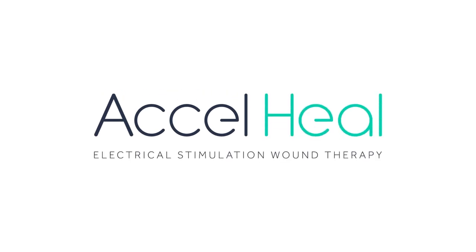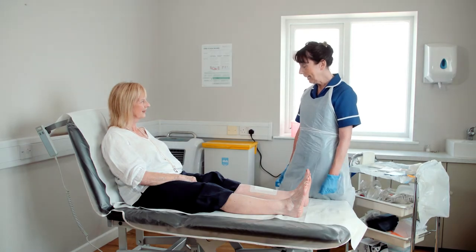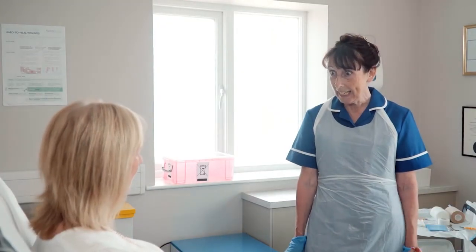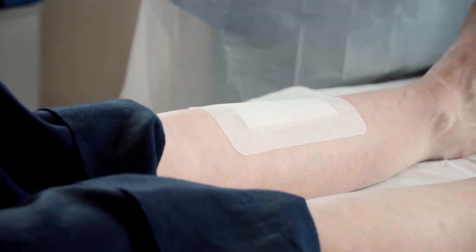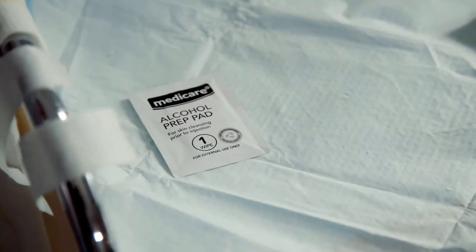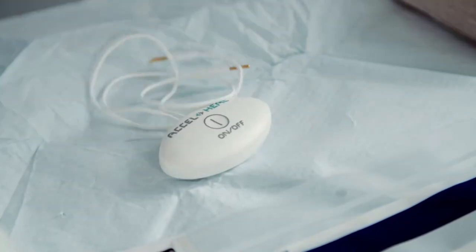This instructional film is intended to demonstrate the application of Axel Heal alongside compression wraps. Our process starts once the primary dressing has been applied to the wound. Make sure you have everything ready and close to hand to ensure an efficient dressing change for your patient.